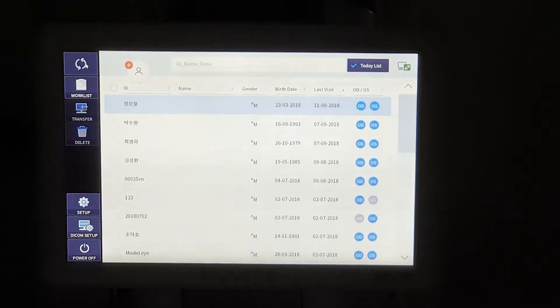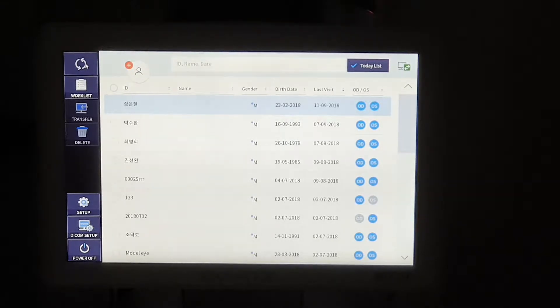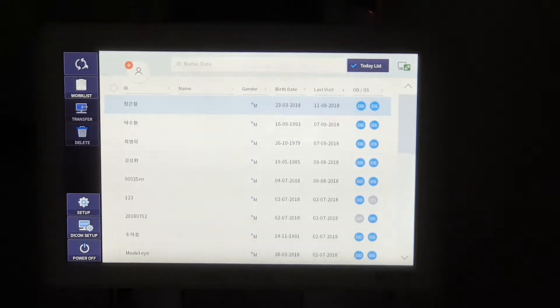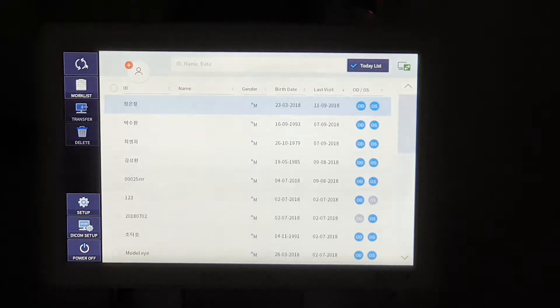Before we take measurement, we recommend to make your surroundings more darker, because it can help to get some more quality of fundus image. Now let's get started.